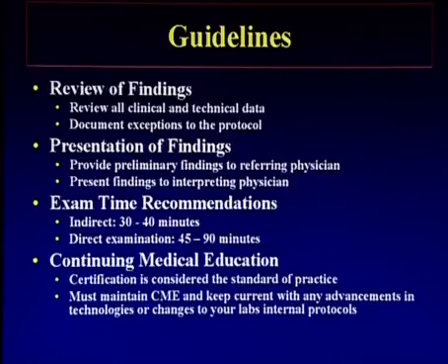The next portion of the guidelines is the time recommendation, and that is divided into 2 sections, an indirect section and a direct section. In the indirect section, that's when you would bring the patient in, you would talk to them, you'd set up the machine, you put your information on either a worksheet or into the computer itself, and then the direct portion of the examination where you would actually do the study themselves.